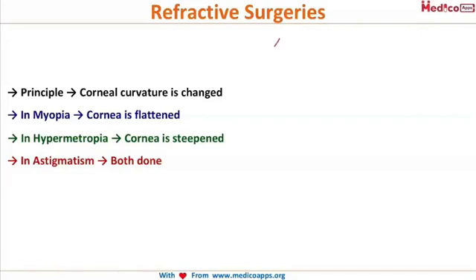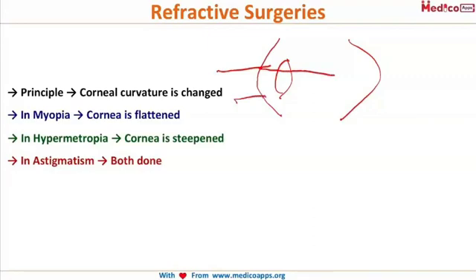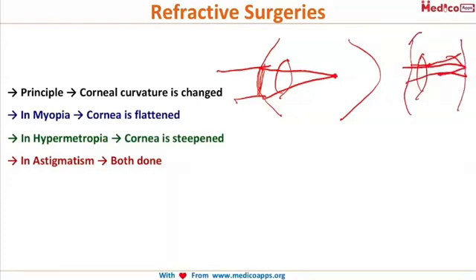First, let's start with myopia. This is the cornea and the eyeball is too lengthy. So what happens here? The light rays come and converge too much and focus in front of the retina. Okay, that is the pathology of myopia. So what we are doing here is flattening the cornea. The cornea becomes a bit flatter like this, so the rays can converge onto the retina. That is, there is no premature convergence of the rays.